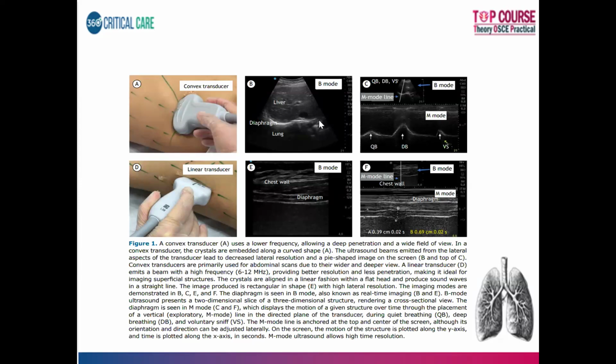in the B mode. It is again in the zone of apposition, which is where the diaphragm meets the rib cage, right? So that is the chest wall and the diaphragm area. When you have this, you have to place the probe in a vertical fashion, cephalocaudate fashion. Remember, for excursion it is in a horizontal fashion, with the curvilinear probe. In diaphragmatic thickness fraction, it is the linear probe in a cephalocaudate direction in the zone of apposition.